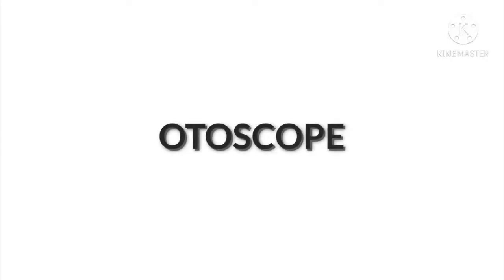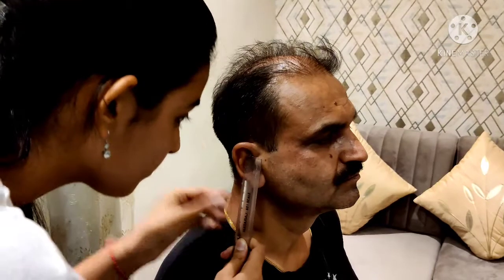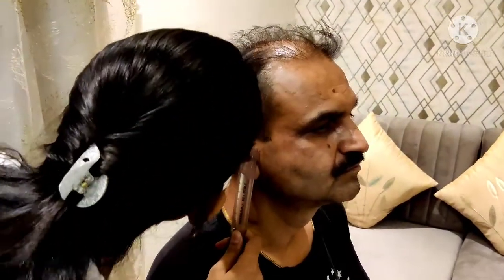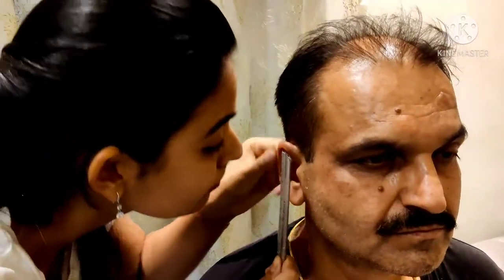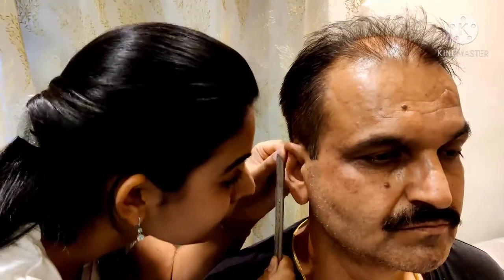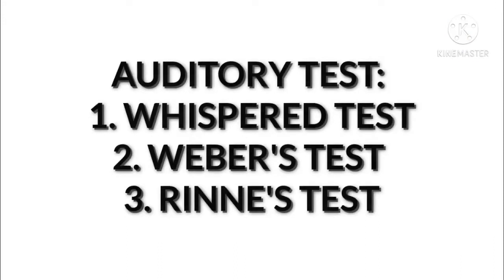Number 2, otoscopy. Due to unavailability, I am using a scale to demonstrate. To see the ear canal and drum, use an otoscope with the largest ear speculum that inserts easily into the canal. Inspect the ear canal, noting any discharge, foreign bodies, redness of the skin, or swelling. Inspect the ear drum, noting its color and contour. The cone of light, which is usually easy to see, helps to orient you.